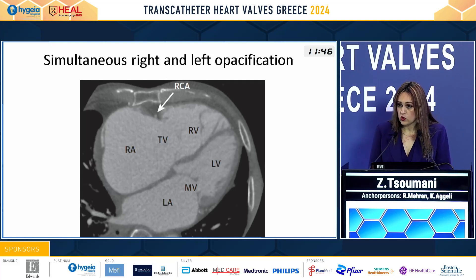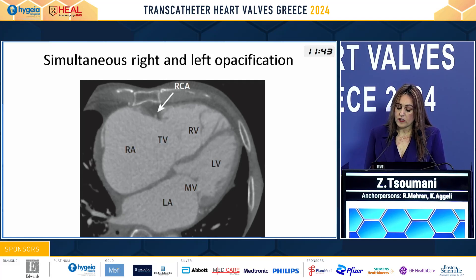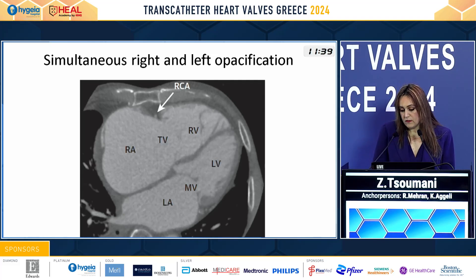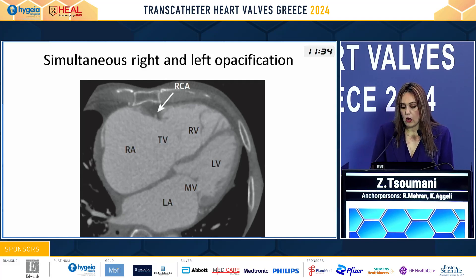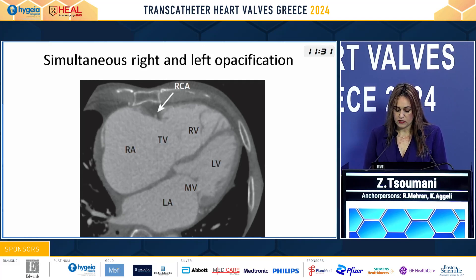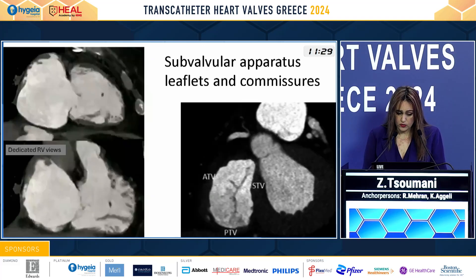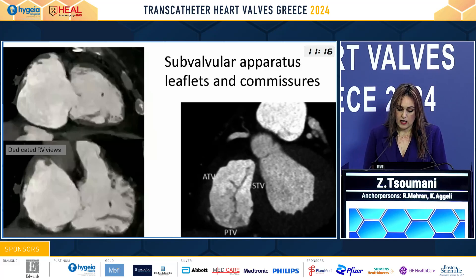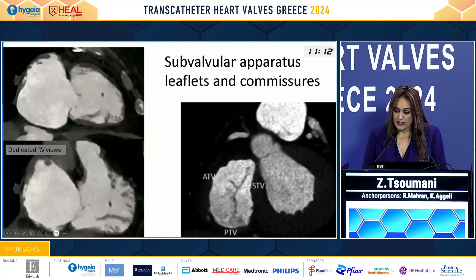However, in the vast majority of cases, we need to assess the right coronary artery at the same time. So we have to shift to our standard thoracic aorta triggering to allow for simultaneous right and left opacification. Using multiplanar reconstruction, we can have dedicated right ventricular views in order to study the subvalvular apparatus, the papillary muscles, the chordae, the leaflets, and the commissures.